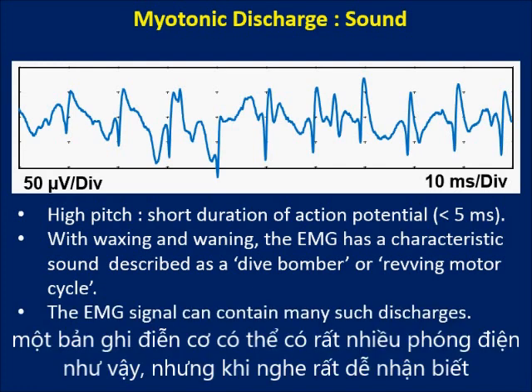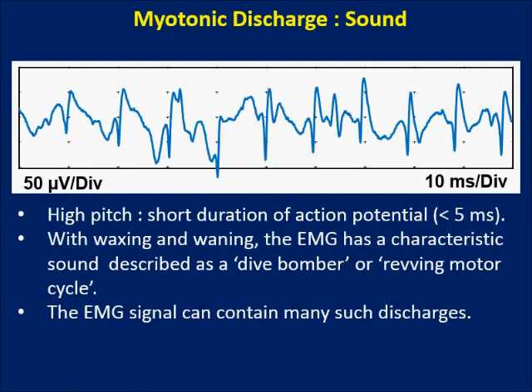The EMG signal can contain many such discharges. Even in a complex signal such as this, one can easily hear distinct myotonic discharges.